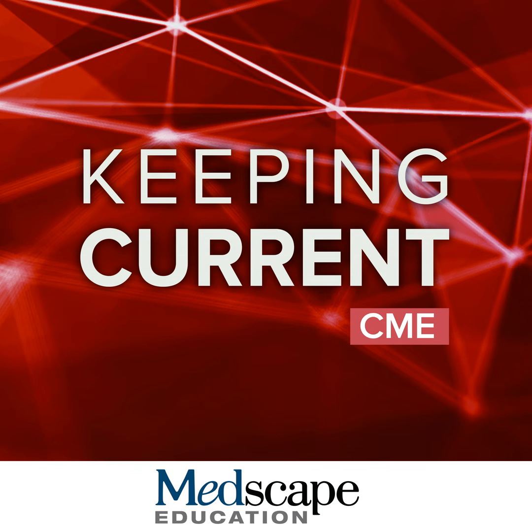So, what is our appropriate use criteria? I think we go back to that manuscript I was talking about earlier. If you are determining eligibility for therapy, amyloid PET is considered to be very helpful and appropriate, as is tau PET, that later stage of pathology. Now, what if we're looking for response? In this case, it's amyloid PET that is considered appropriate because our treatments right now are targeting amyloid pathology. So we're looking for a change on amyloid PET from an amyloid treatment.